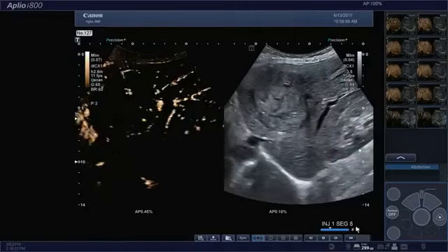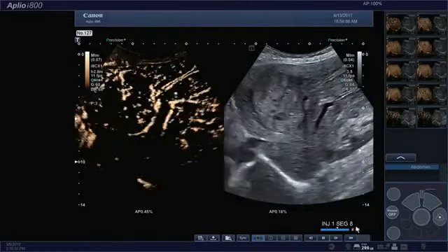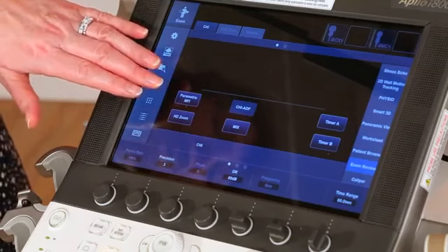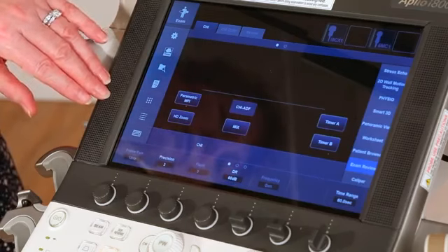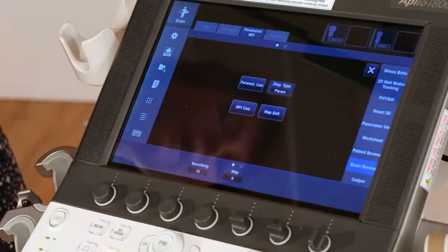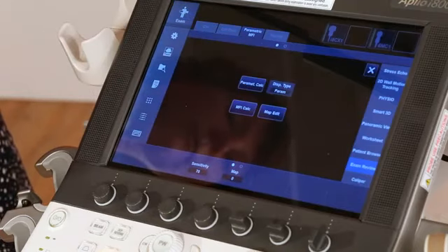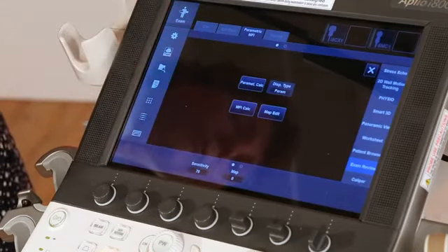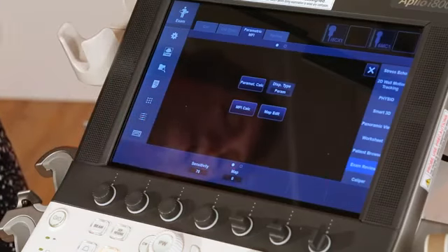Let's take a look at how easy it is to perform on the Aplio i-series. First, you're going to bring up a clip from either the hard drive or from your study. Then you're going to select parametric MFI from the touch screen. Notice how all of the controls are immediately available to you. Once you've selected parametric MFI, the dedicated screen comes up where you can choose your display type or parametric calc, and at the bottom this is where you will find your preset maps.